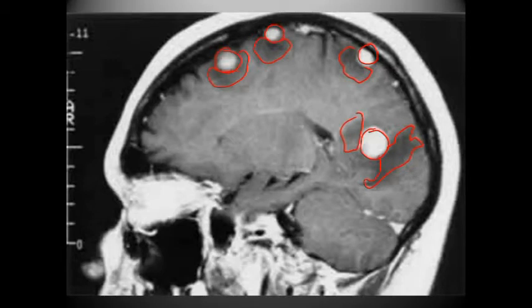It's presumable to say that these blackened areas are areas of edema, where the mets are growing and pressing on brain matter, causing an associated edema or mass effect around them. Based on this image, we can't really determine if there's a midline shift or not based on the size of the masses, but it's presumable to say that there are other cognitive effects.